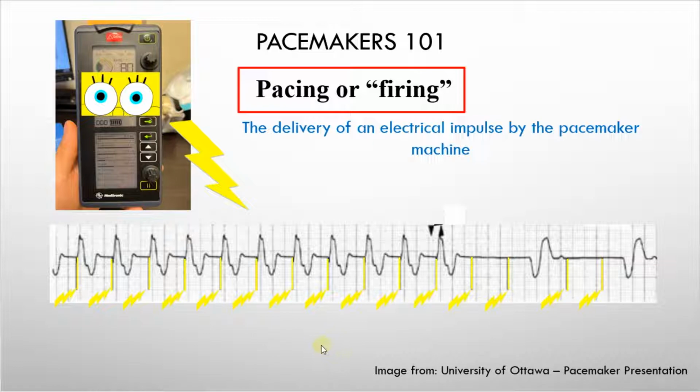And one principle in cardiology is that electrical always comes before mechanical, meaning that there must be electrical stimulation in the heart before the ventricles or the atria can depolarize. And this is a principle that we can definitely see in the pacemakers. As you can see, the pacing spike, the electrical, will always come before a mechanical depolarization, okay?